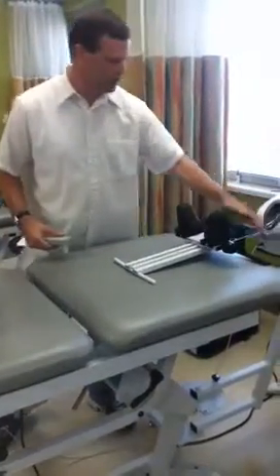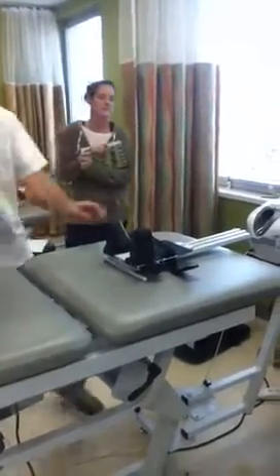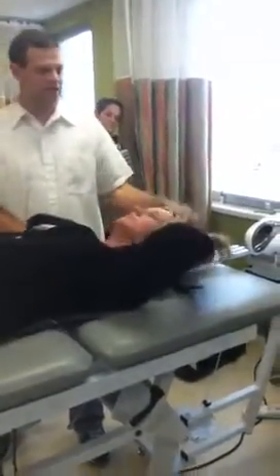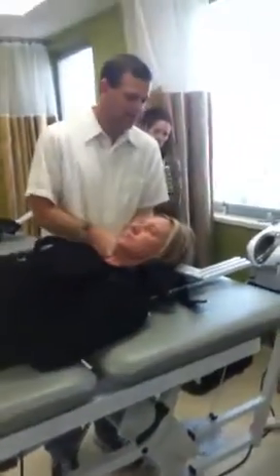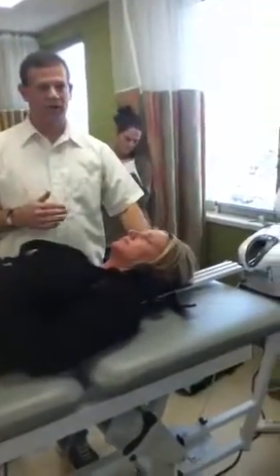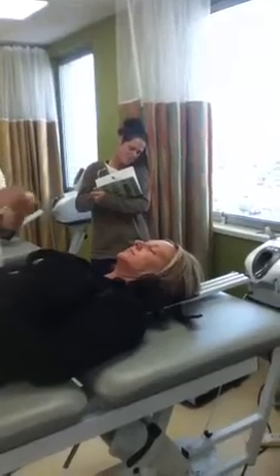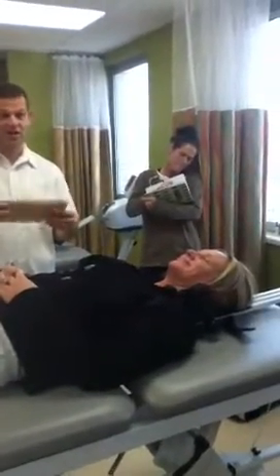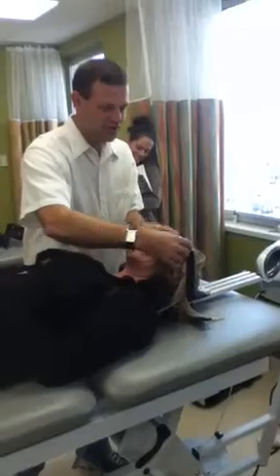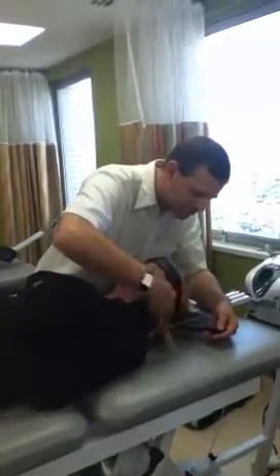So we're going to do a new alignment — I'm going to go to the angle of the occipital part. Is that straight? It looks straight. Now we need to pull your hair out of the way so that your neck skin is against the machine. We also want to put a strap across her forehead. We like to protect our machine from her and her from our machine, so I've pulled a little paper towel that you can use — nice and soft — so she's not pushing up against vinyl that could have been on a dozen other people.